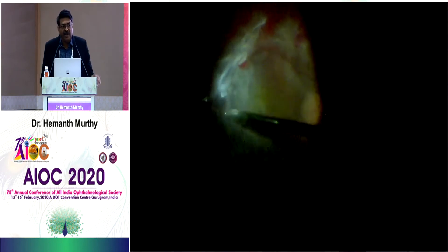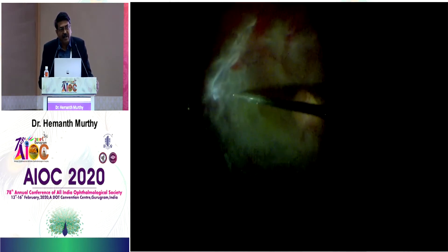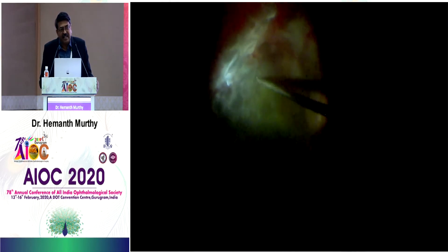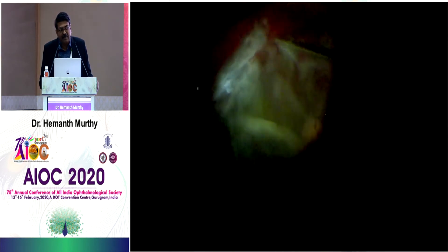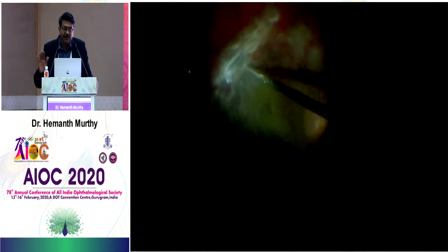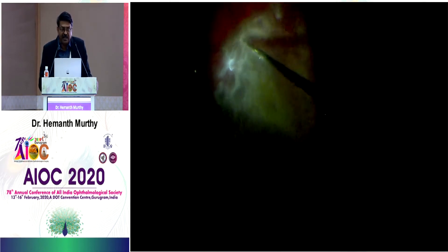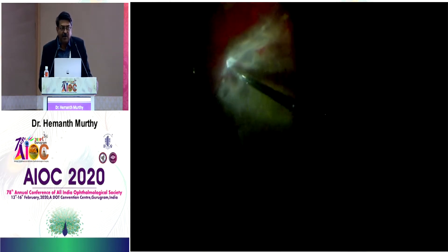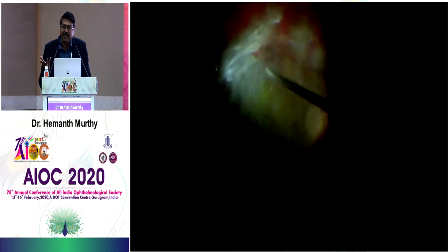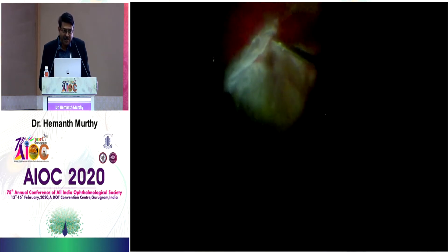Another way to identify the cleavage plane — in this second video, you can see I'm trying to dissect this membrane, and there is the plane of cleavage. Remember that diabetes creates multiple layers of membrane, so unless you are in the correct cleavage plane, you will not be able to dissect it. I'm now going underneath that membrane doing blunt dissection — nothing else — it just separates out.